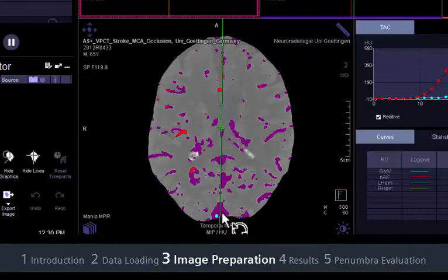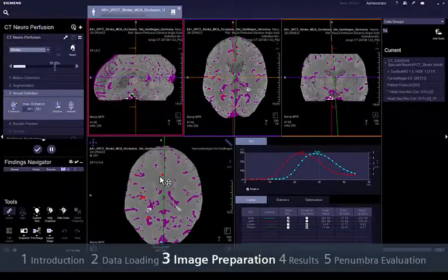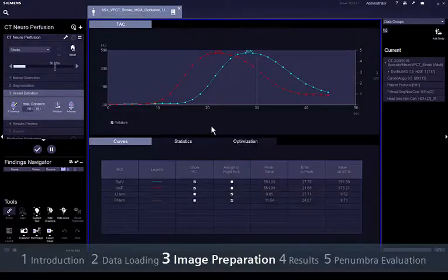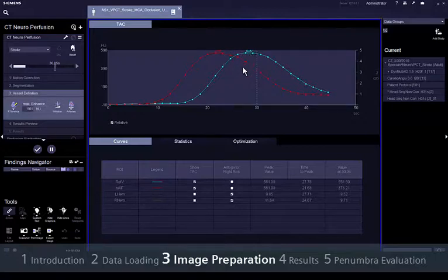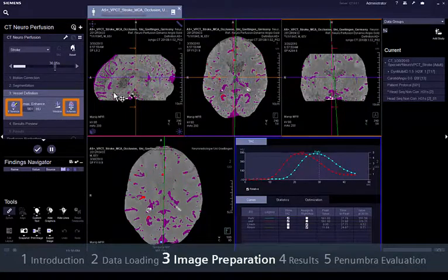The arterial input voxels are marked in red. Just verify that the detection is correct. Time attenuation curves will help to determine if they are plausible — the peak of the red arterial curve should lie in front of the peaks of the blue venous curve. If any curves are not satisfactory, they can possibly be improved by manual definition.